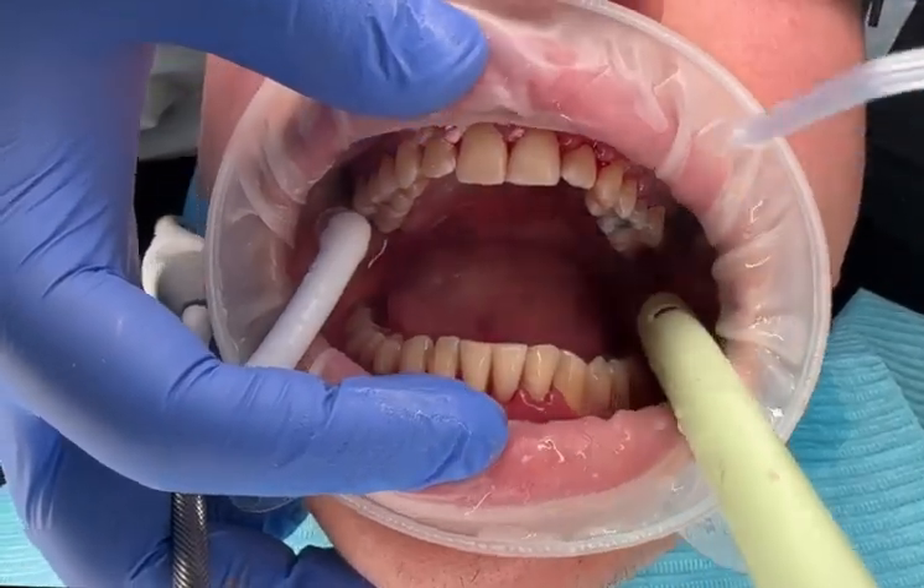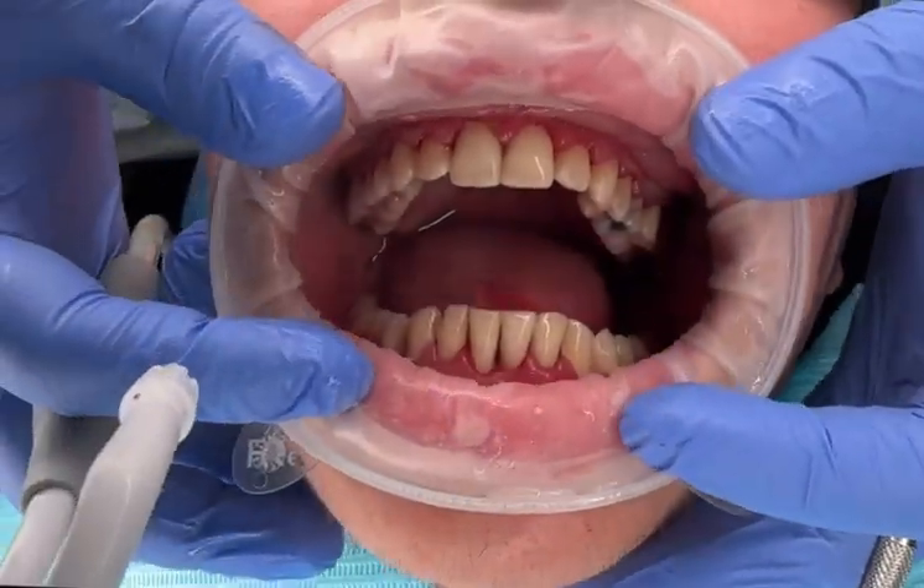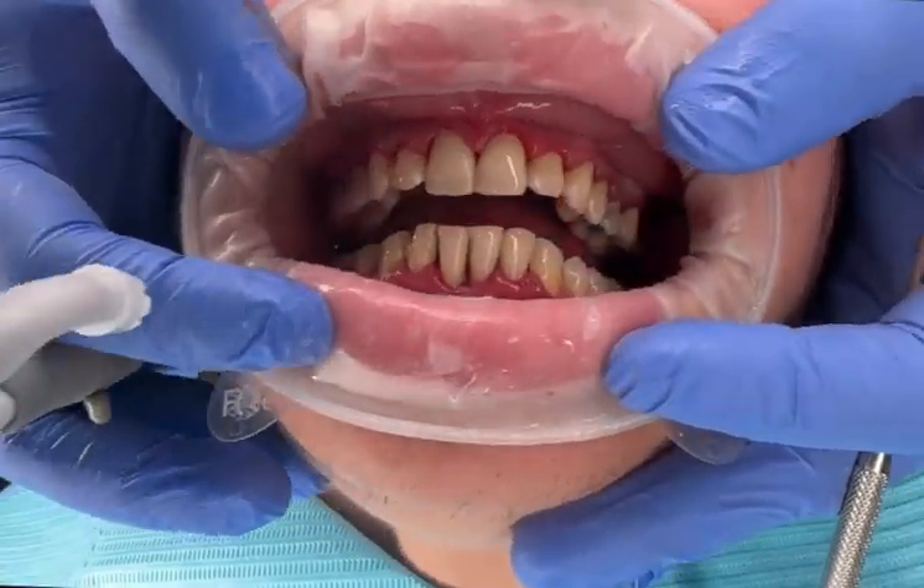Stage 4. Final wash to reveal a plaque-free oral cavity. Join us again for more videos. Thank you.